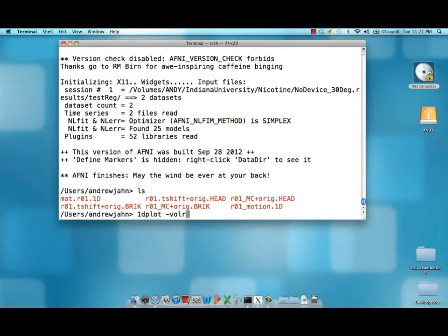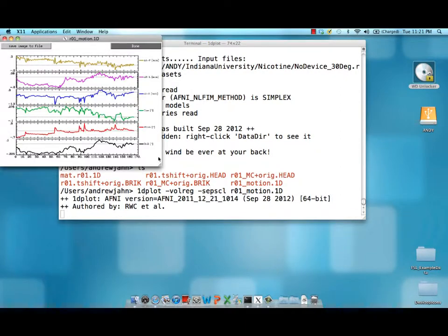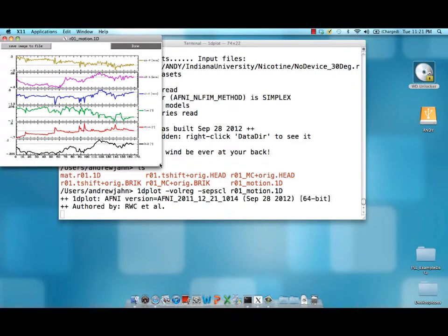R01 underscore motion. So, 1dplot dash volreg dot sepscale R01 underscore motion.